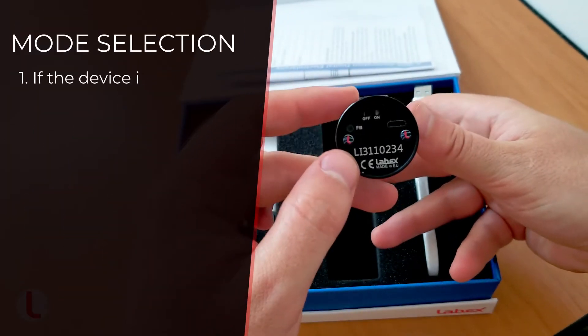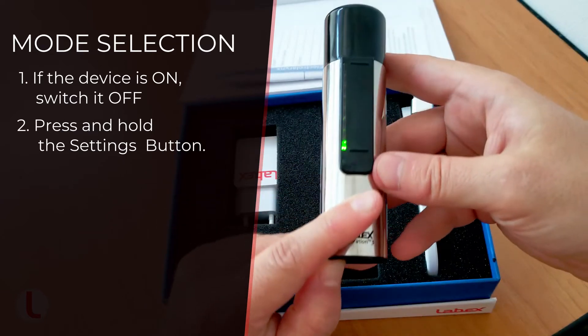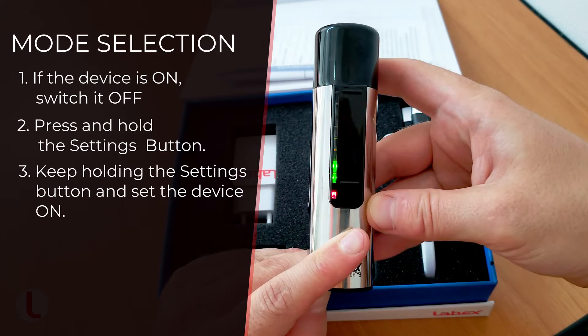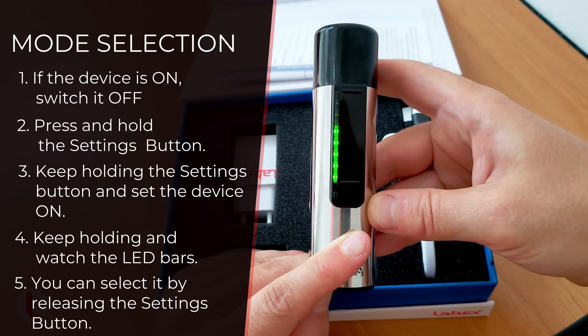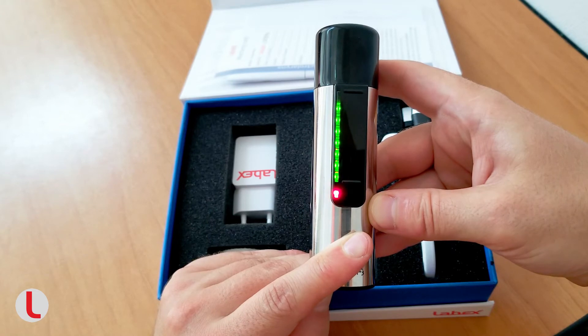The procedure for selecting any of the modes is very simple. If the device is on, switch it off. Press and hold the settings button located on the back cap. Keep holding the settings button and set the device on. Keep holding and watch the LED bars. Count the number of LEDs that are on — this number correlates to the number in the modes list. You can select it by releasing the settings button. The numbers of the modes refer to the count of the LEDs that are lit up at the moment of releasing the settings button.